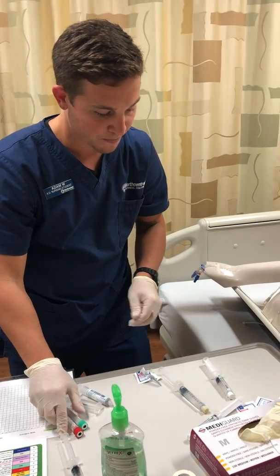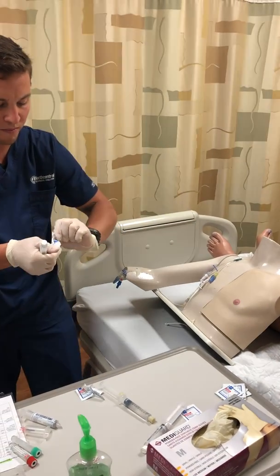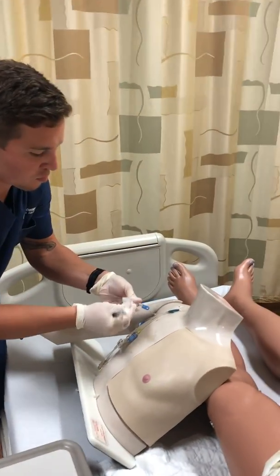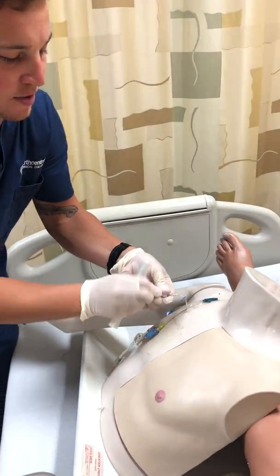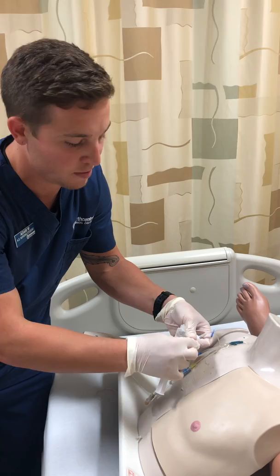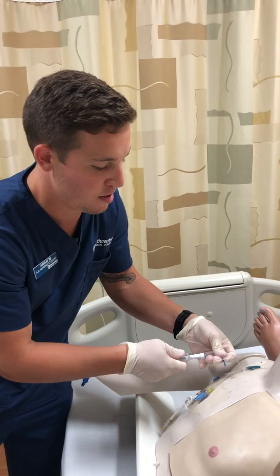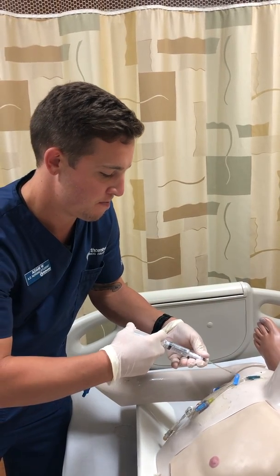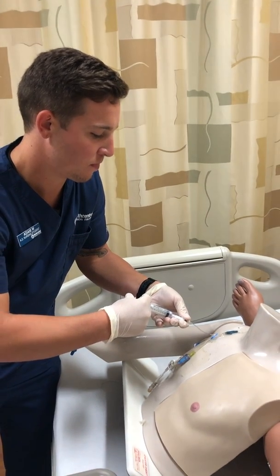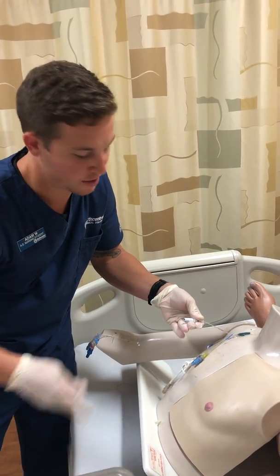So what we do next is finish flushing our central line. So clean, 10 to 30 seconds, alcohol swab, attach without a cap, unclamp. Good. Okay, then we have that last flush here.